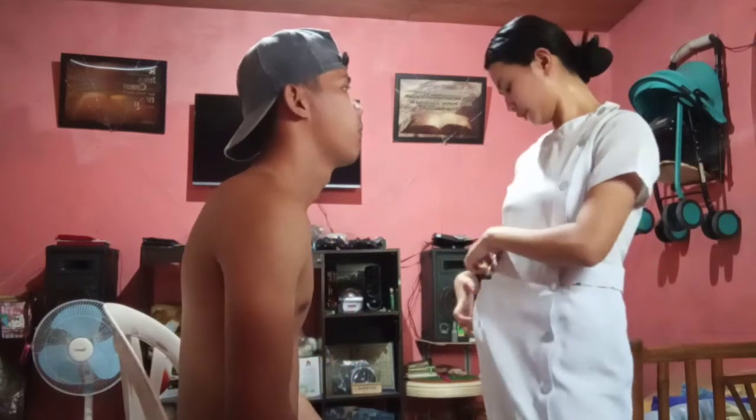So we will be using the stethoscope, and we will be listening to the full cycle of expiration and inspiration of the patient, and then pay attention to the bronchial, bronchovesicular, and the vesicular sounds.